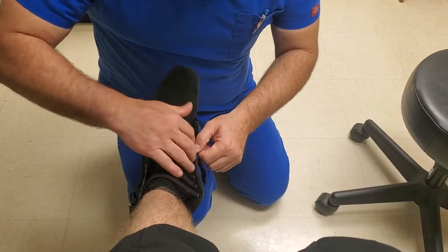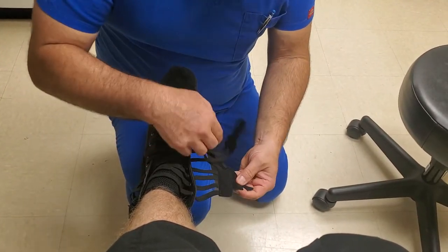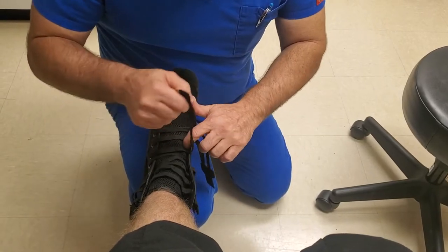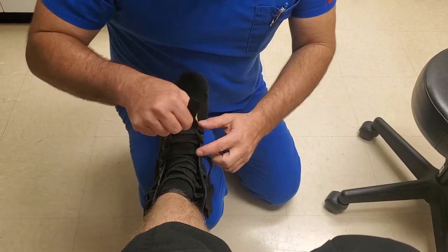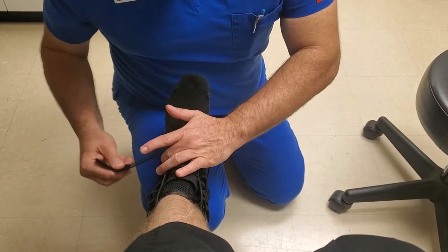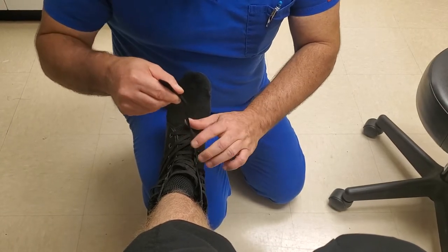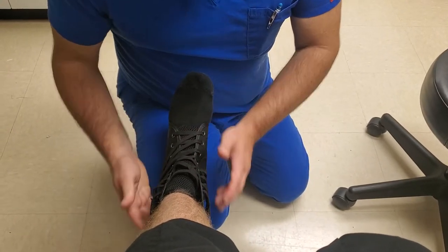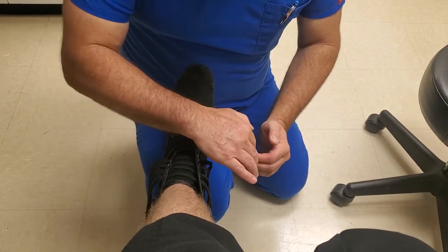Make it look nice and neat and proper. You take the two lower straps — the two lower velcro laces if you will — and what you want to do is cinch them over and slant upward just slightly. Same thing with the second one: over, and give a nice little tug so it fits snug. And then the upper set of laces, you want them to go the opposite direction.